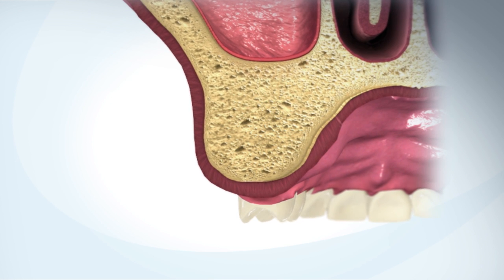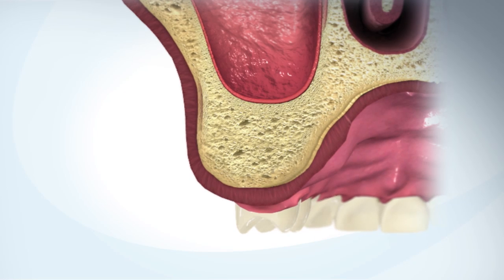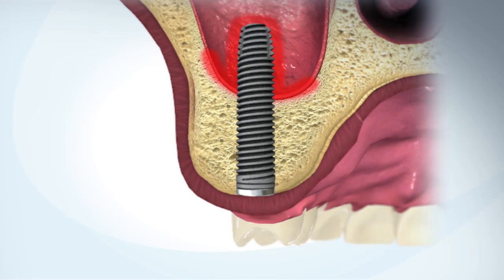With age or in case of tooth loss, the sinus expands and the jawbone atrophies. In many cases, the remaining bone has insufficient volume to support dental implants.